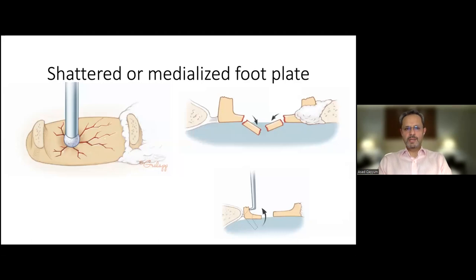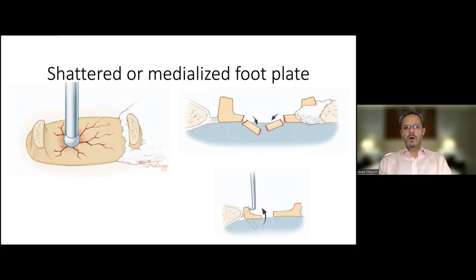You may encounter complications. If the patient has a biscuit footplate, the moment you touch the skeeter drill the plate can shatter or fracture. Alternatively, a part of the bone can fall into the vestibule, or the annular ligament can fracture, leading to subluxation of the edge of the footplate. In these scenarios, you can use a gentle right-angle hook to lift dislocated fragments out — but don't venture too deep into the vestibule because of the risk of a dead ear. You can use a perichondrium or vein graft to cover the shattered footplate and put a prosthesis on top.